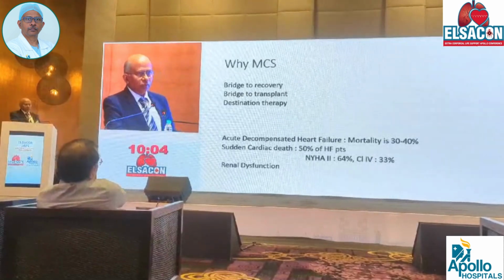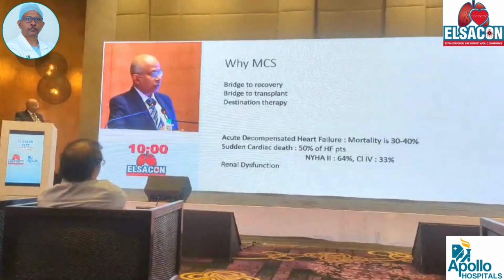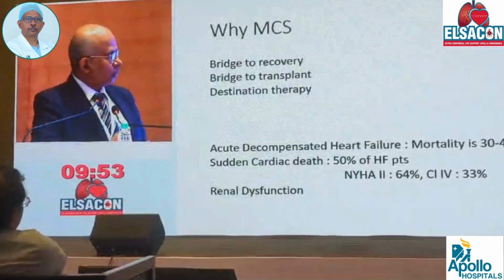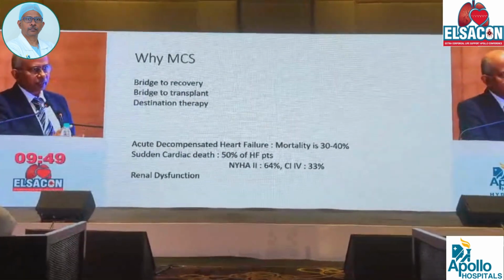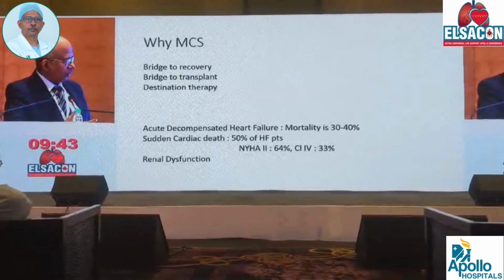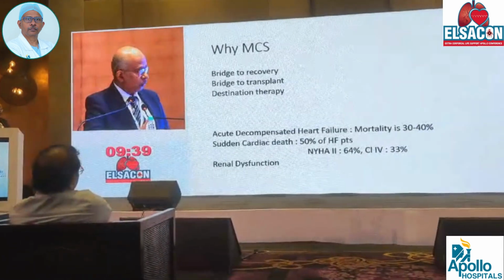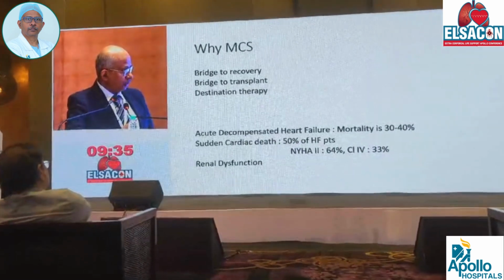So why do we need the mechanical circulatory device or a VAD? These are the three main aspects: either bridge to recovery, bridge to transplant, or as a destination therapy. Whenever we put a permanent VAD, that is destination therapy. As we have been discussing all throughout the conference, the mortality of acute decompensated heart failure is roughly 30 to 40%. Sudden cardiac death in heart failure patients is 50%.